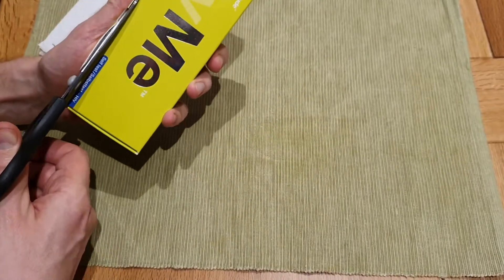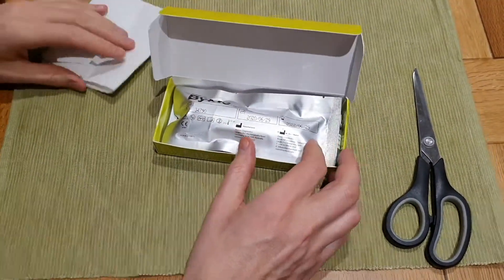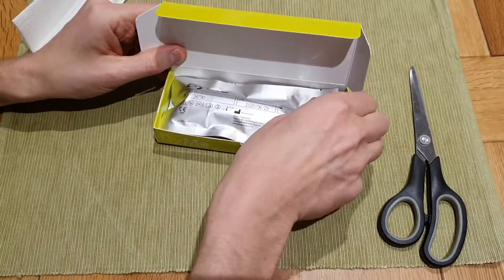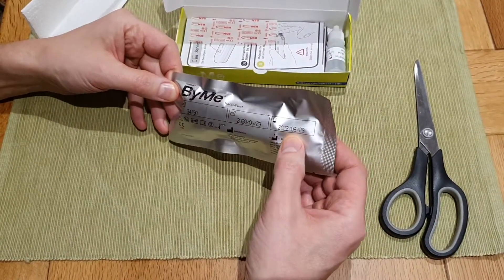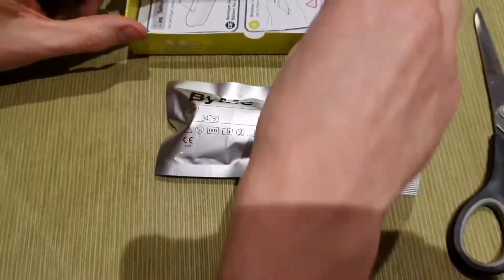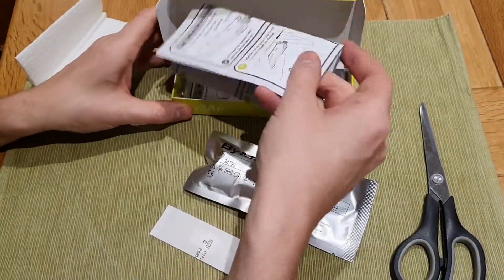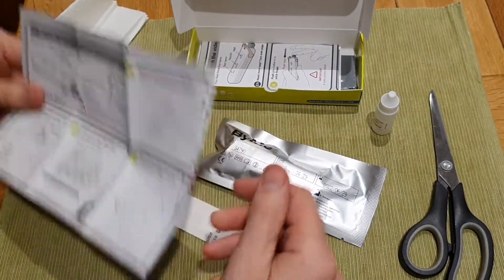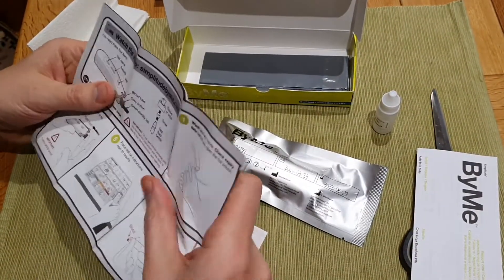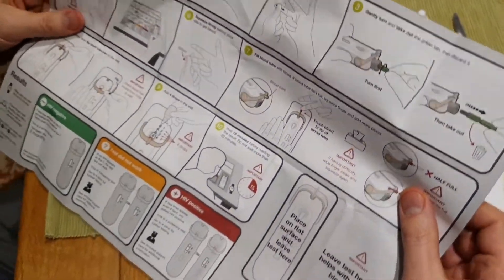I've never used this test before, so I've got a pair of scissors already prepared. Let's see what's in the box. I've bought some tissue paper because obviously a point of care test you need to prick your finger with. There's a buffer solution, there's a plaster — oh, that's nice of them. Some instructions which are in German, and some instructions which are in English, which I'll open up and refer to later.